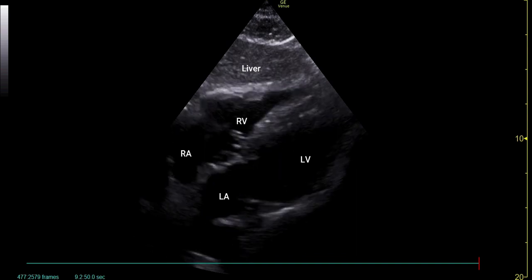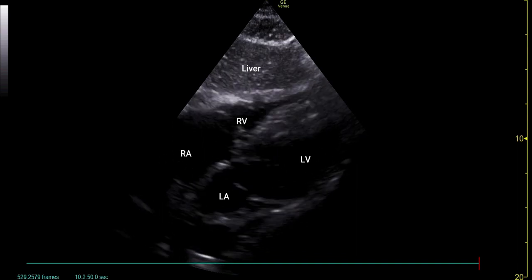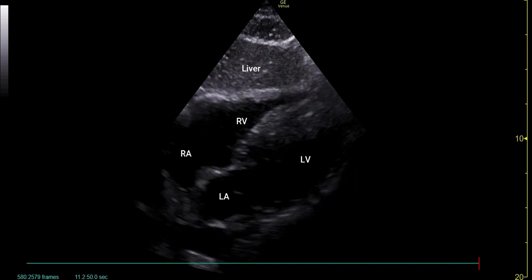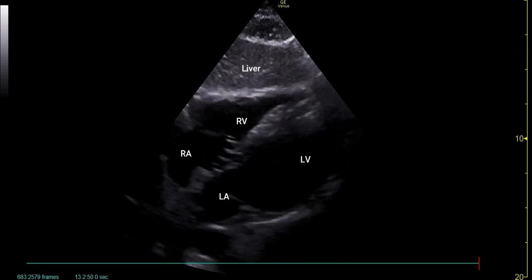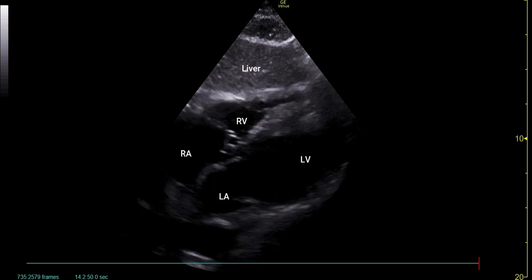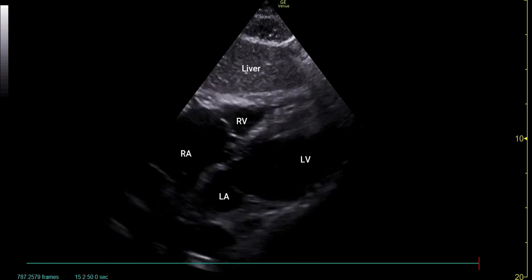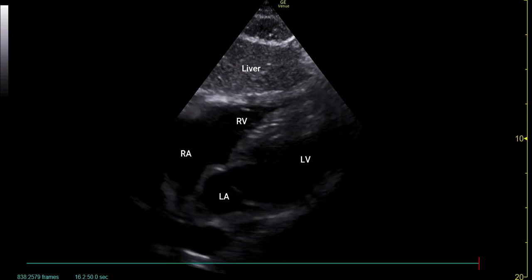Here we can see the subcostal view in a healthy patient. We can identify all four chambers of the heart and can see the bright pericardium surrounding the heart.